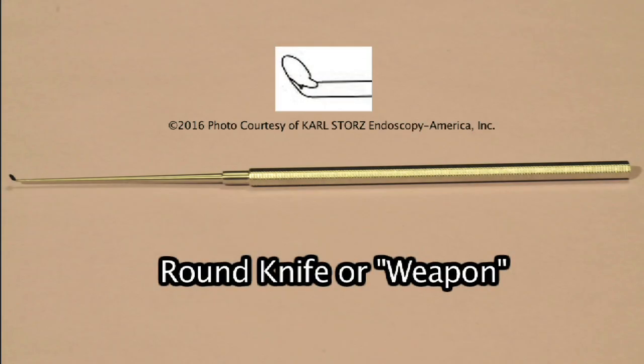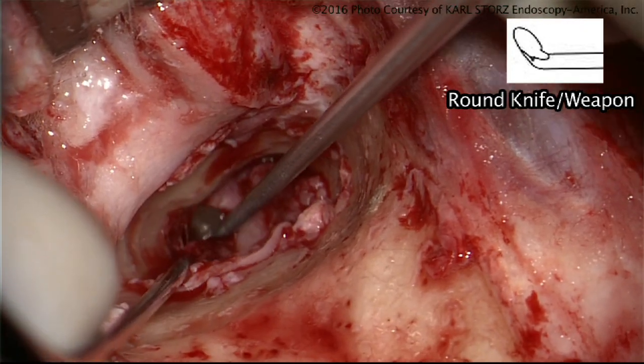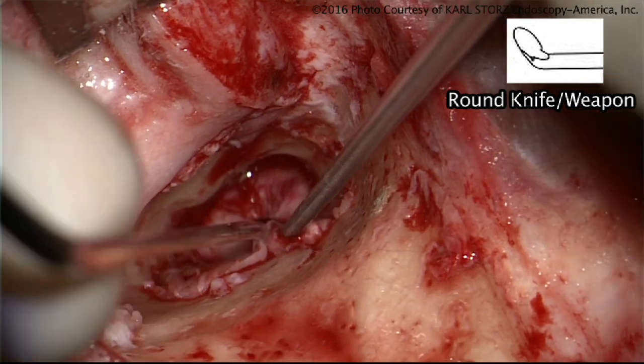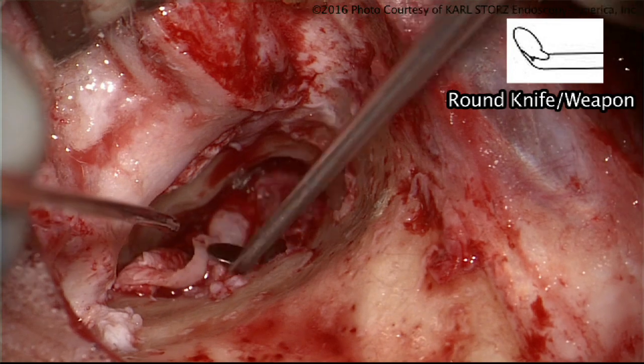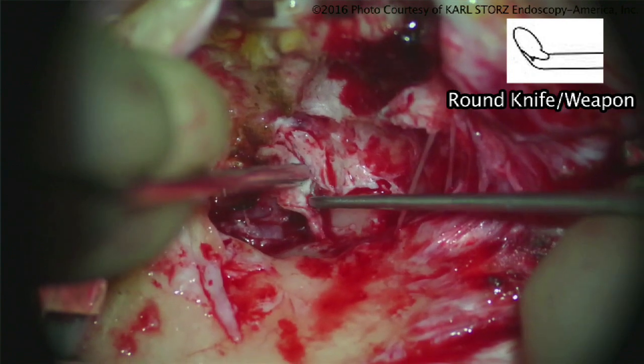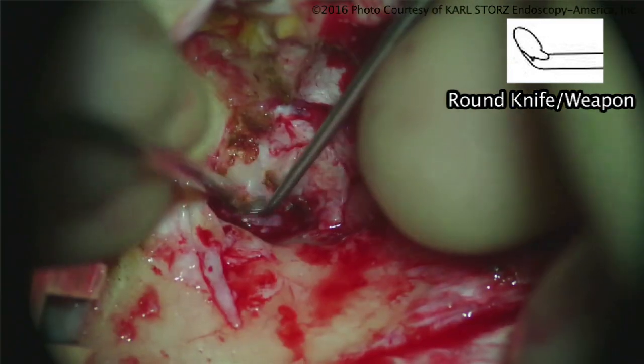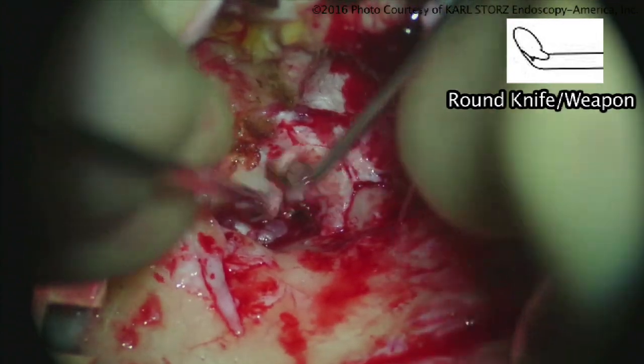This is a round knife. The round knife was described by Jim Sheehy as one of his favorite instruments — he called it a weapon. I asked him why a weapon, and he said it's his secret weapon. I will usually use this at the very beginning of the case to elevate the ear canal while we're entering into the middle ear space. I also find it very helpful at lifting up the annulus. When it's very sharp, it can get into the groove of the annulus and lift the fibrous annulus out of the eardrum. This is basic for any ear surgeon — you could almost say the round knife is the symbol of an ear surgeon, like the caduceus is for medicine.